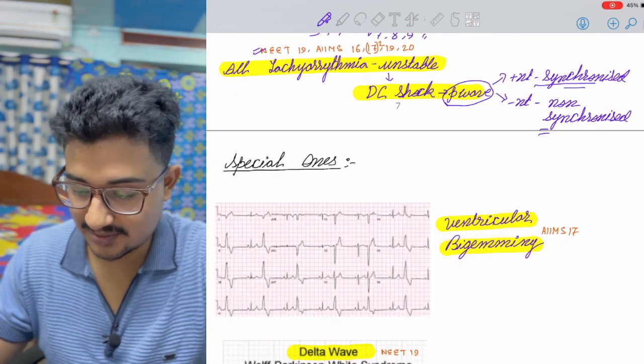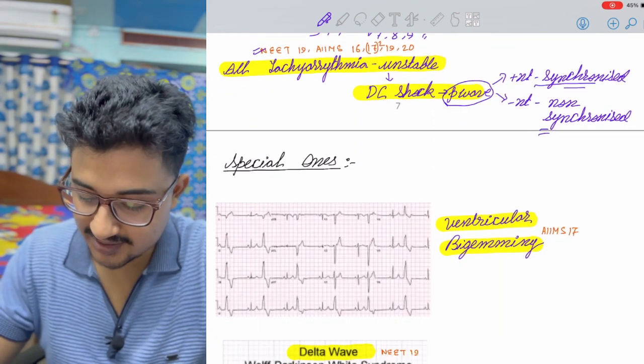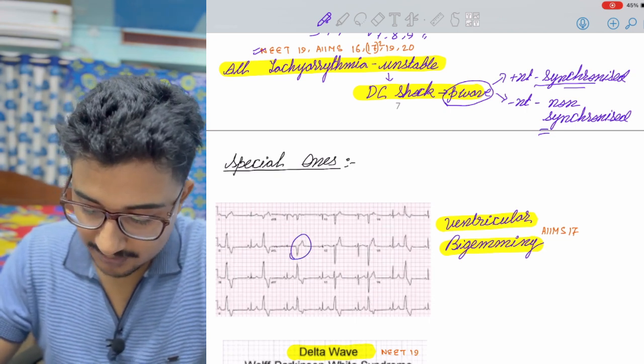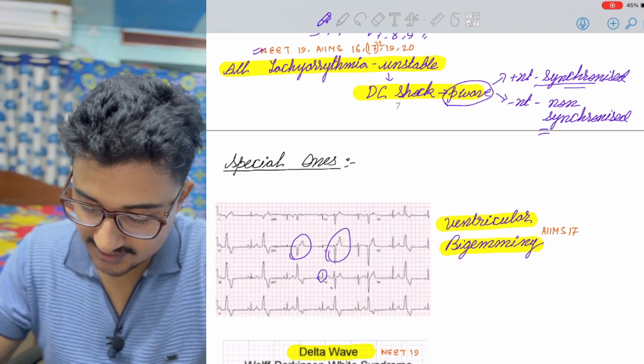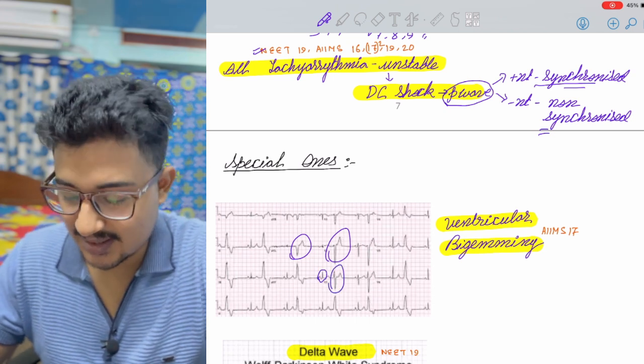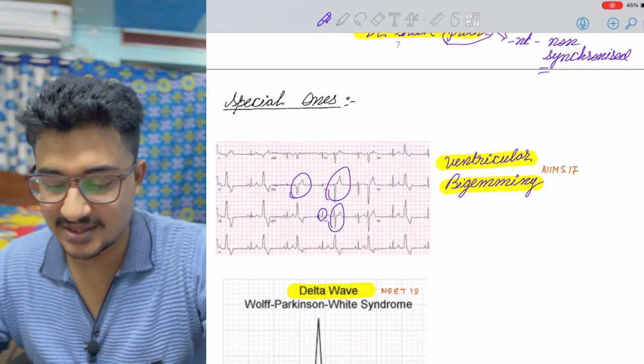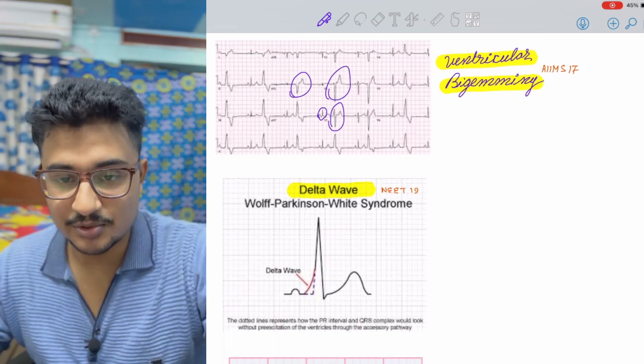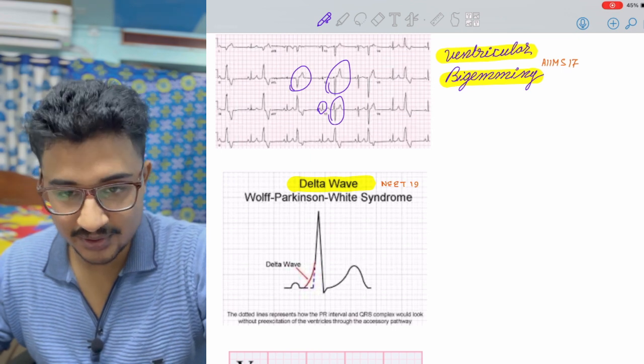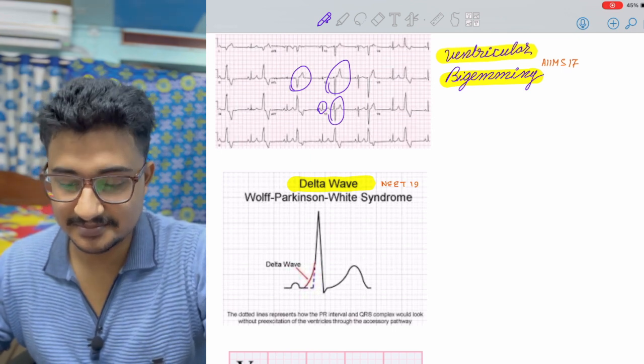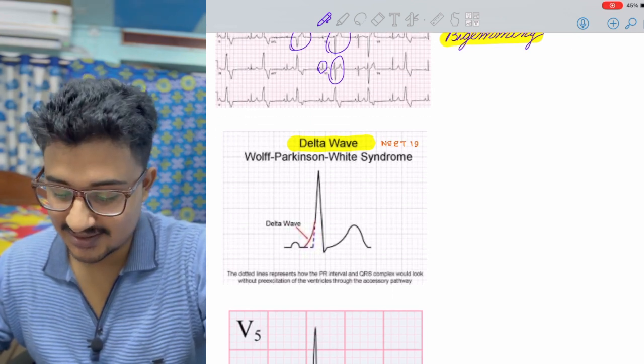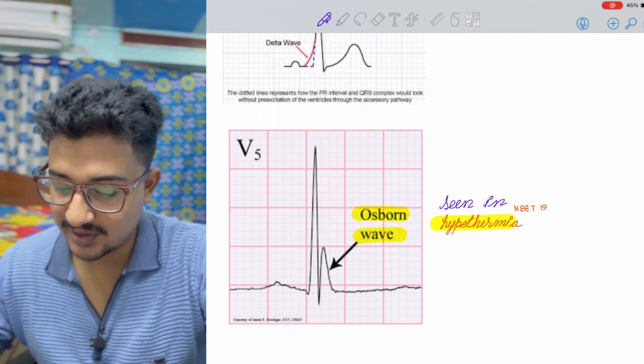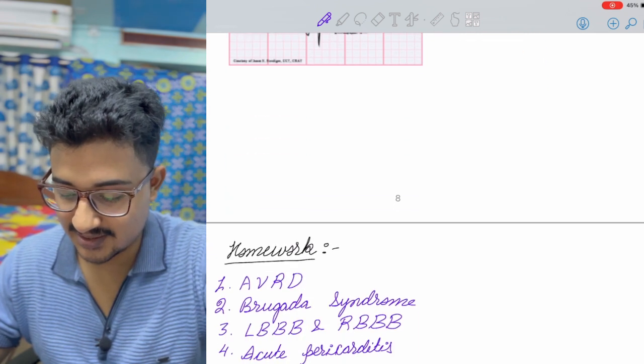Coming to one or two special patterns, here you can see ventricular bigeminy that is more than two morphologies of QRS complex like this and this, these two morphologies. It is seen in cases of digitalis poisoning. And then is the delta wave that you see in WPW syndrome. You all know the concept, if you don't, go study your ECG classes. And Osborne wave is seen in hypothermia, it was also asked in NEET.